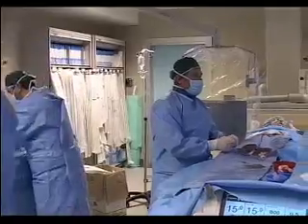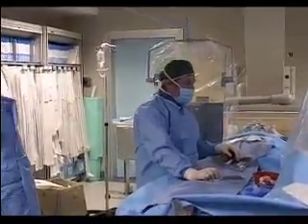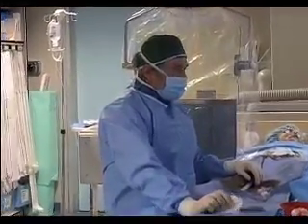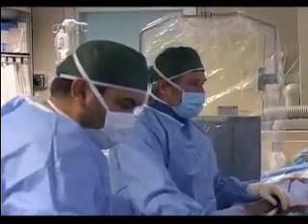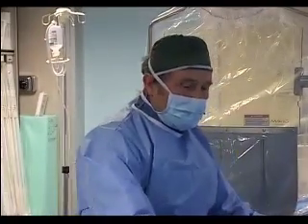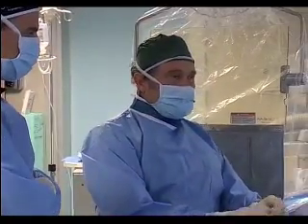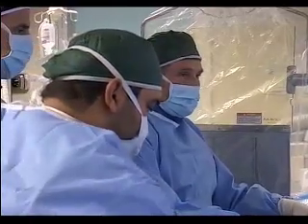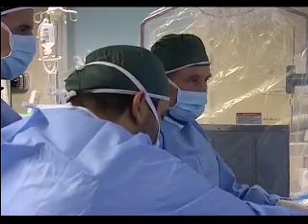Thank you. You think it's too small for this duct, Joe? I think so. I think so. Because you had a 6.4 with a large shunt. And I think it's just going to pull through. But you can try it. I did that exercise last week. Yeah. And a 2-kilo baby, and yeah, I'm pretty sure that's what will happen. And what was the result? I feel the same way, Mario. I think the 5 is too small for this ductus. The 5 is too small is quite possible, yes.